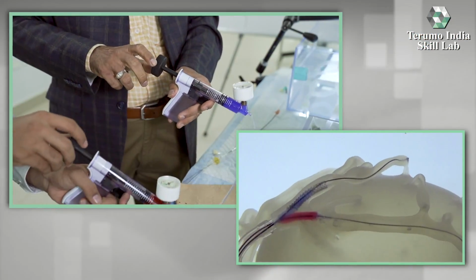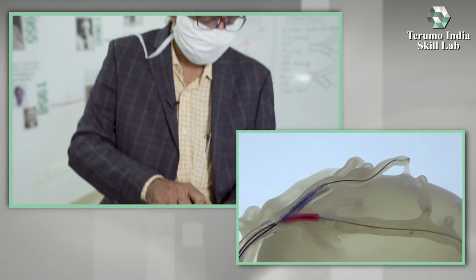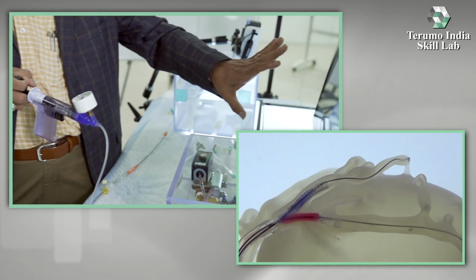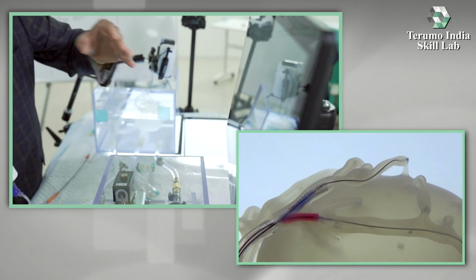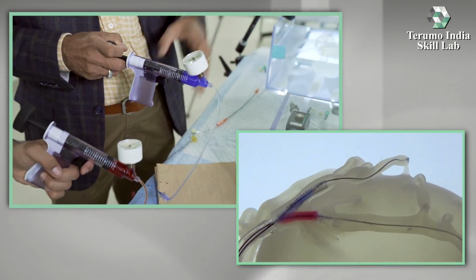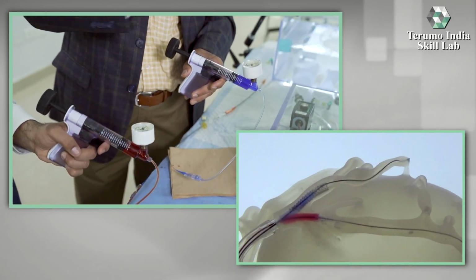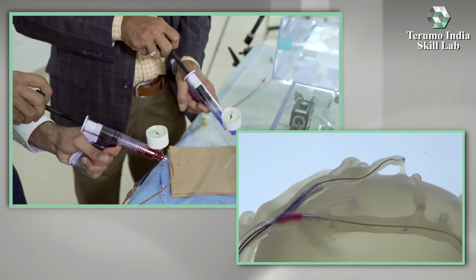Yeah, 10. These are NC balloons, so optimal pressure is 12. So we go to 12 slowly. So this is how the side branch stent deployment is optimized. And now you will see the crush stent is further pushed towards the upper edge of the vessel, the upper roof or upper margin, so that when you put the main stent, the pathway is very clear. Nothing protrudes in the main vessel when you put the main stent. Yeah, so deflate.